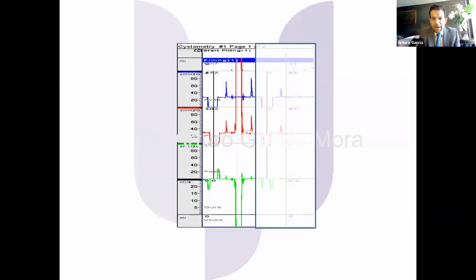So this is a thing I did with a patient. This is not what we usually do, but I did it so you can see what happens before we hit start on the machine. Most of the machines you're going to find in the market, you're able to zero, flush the lines, check quality control, and adjust the height before you start recording the trace. In this case, as you can see here, this left part of the trace is usually not seen. I recorded it just to make sure you could see what we do before.